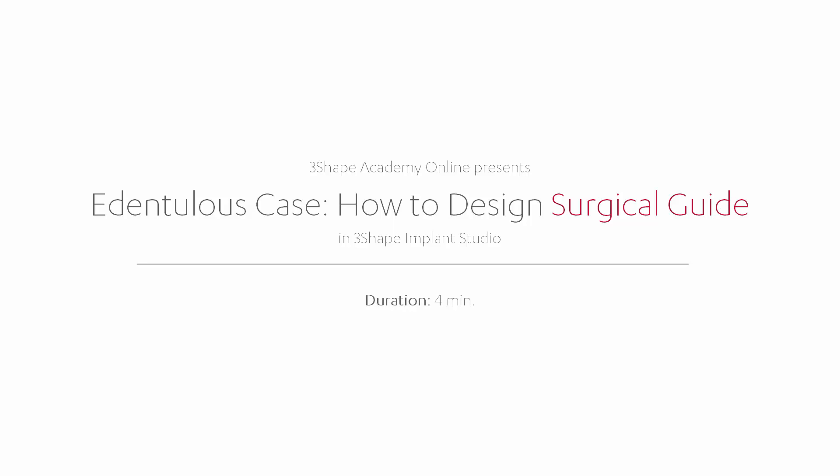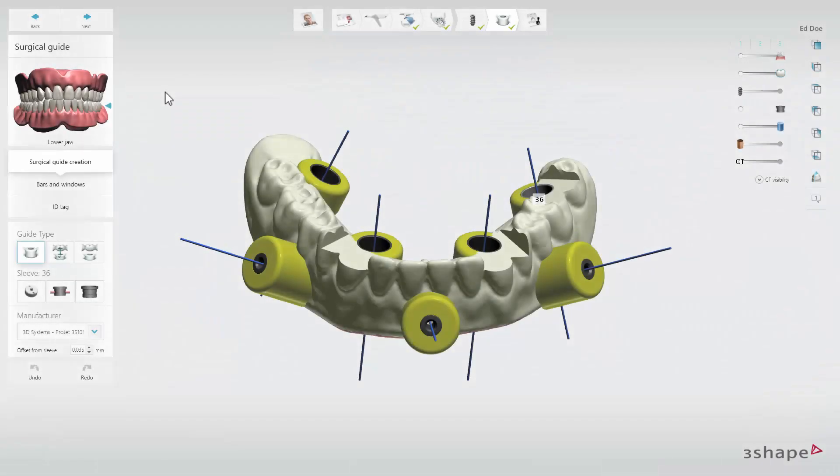In this video, you will learn how to design an edentulous surgical guide with 3Shape Implant Studio. At the surgical guide step, you can design a surgical guide based on your implant planning. The initial guide will be generated automatically and is based on the denture scan and the implant planning.